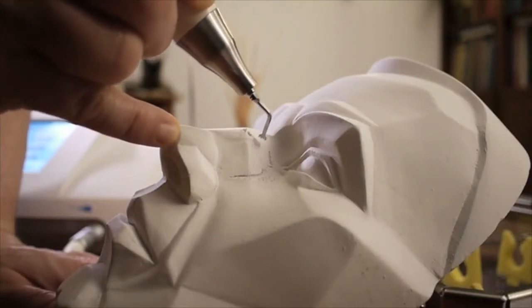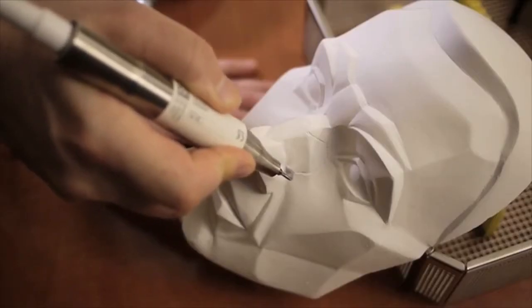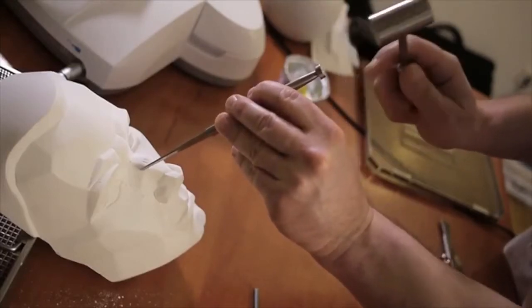All this can be done safely because piezoelectric instruments have a very gentle effect on the bones, unlike the mechanical instruments. Therefore, they don't destabilize bones the same way as mechanical instruments do. Bones are less likely to collapse in the airways even after a complete osteotomy without any area of greenstick fracture when piezoelectric instruments are used. This bone stability has been observed in the cadaver dissection performed with different rhinoplasty surgeons and described in this article, and it has encouraged us to use the extended dissection clinically.